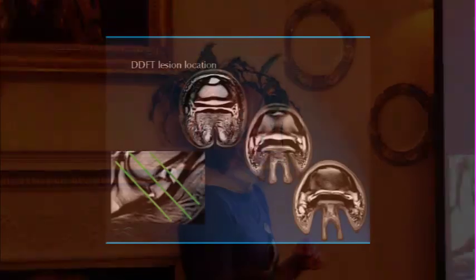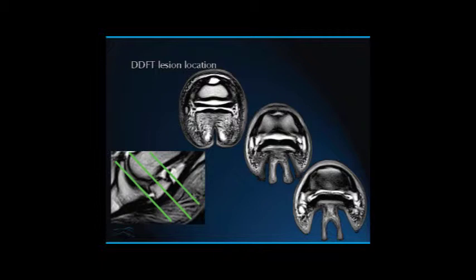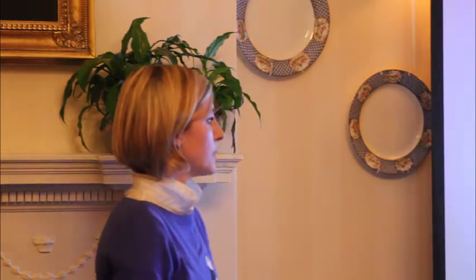Whereabouts do we see them? This is the sagittal slice here, and the green line represents what the transverse image is showing you. We often see them proximal to the navicular bone, within the proximal recess of the navicular bursa, or we see injuries over the back of the navicular bone — the compression and fibrillation injuries. And then more distally, insertional injuries adjacent to the impar ligament. Those three areas are quite important because they do have slightly different prognoses. Injuries in the proximal recess of the bursa can often be more of a problem than the more degenerative, quieter lesions over the back of the navicular bone. Insertional injuries, in my caseload anyway, can be quite problematic.